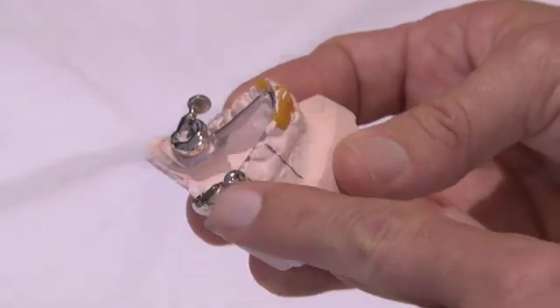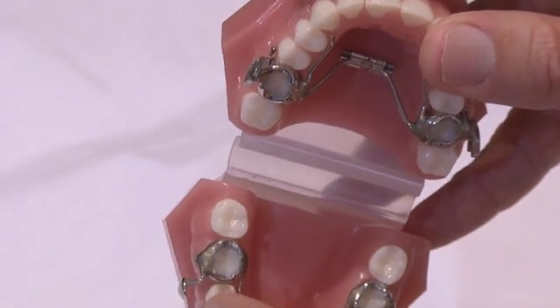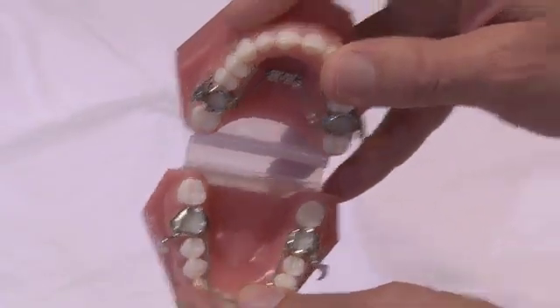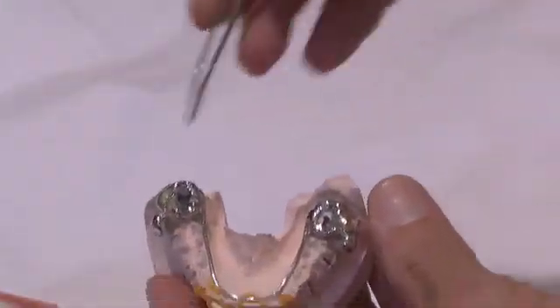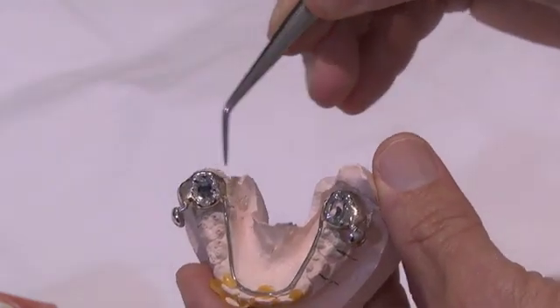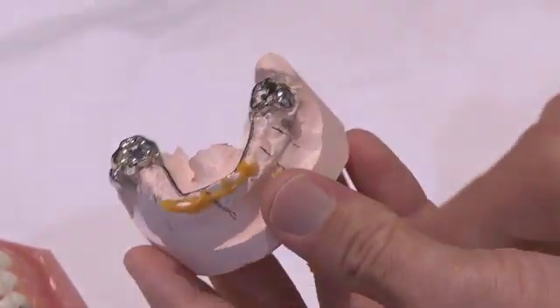this buccal shield so that we get less cheek irritation. If you look at the original buccal shield, the buccal-lingual dimension was a lot, and that caused a fair bit of cheek biting. The new buccal-lingual dimension has been reduced, and I find that a lot more comfortable for patients. So, the lower part of the MARA: lingual arch, stainless steel crown, and a soldered buccal shield. You'll see the purpose of the buccal shield in a moment.